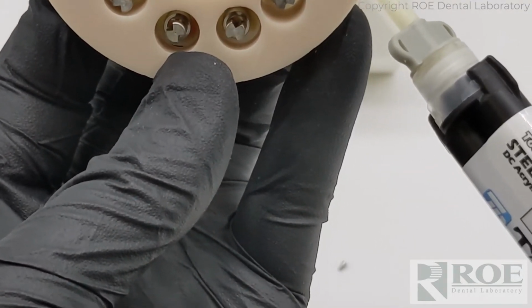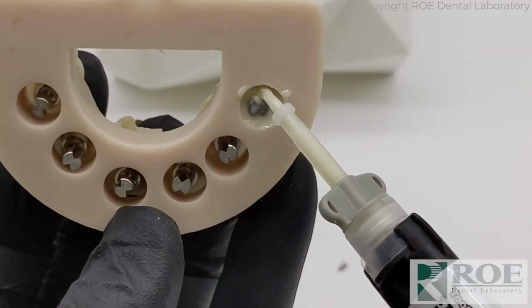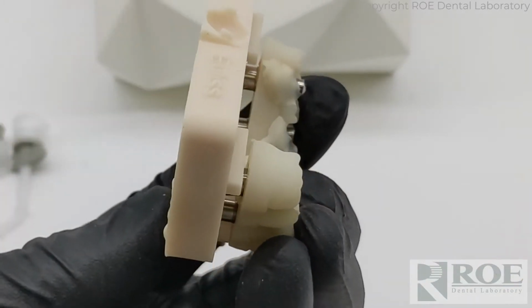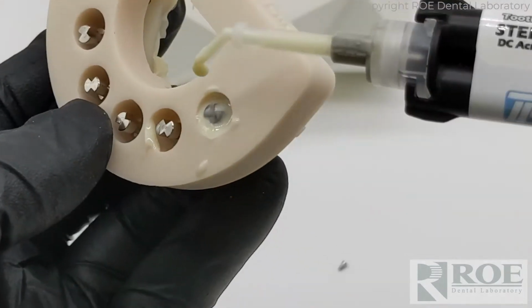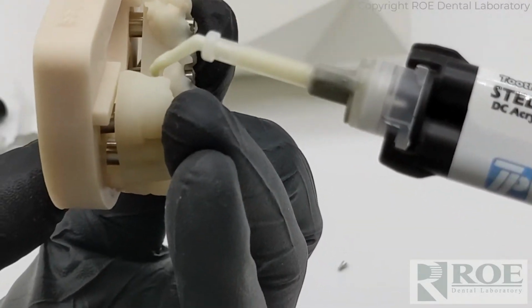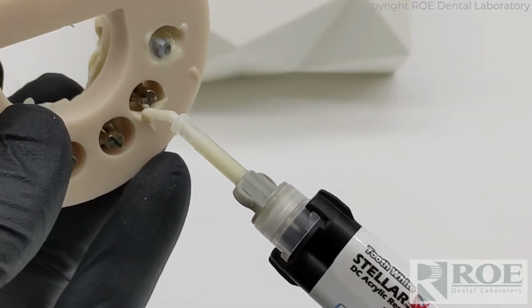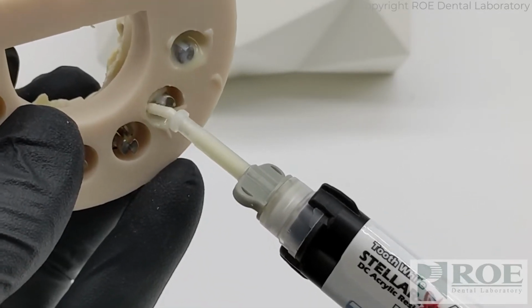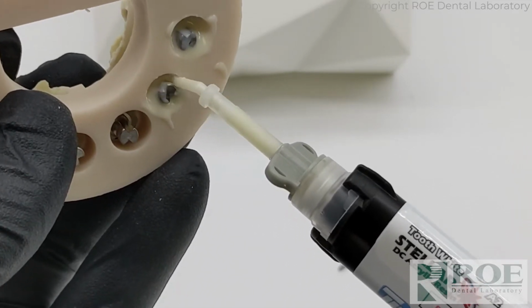But the other very important thing is to not connect the prosthetic to the model. In other words, we are holding this vertically so that you don't have material going all the way through the hole and connecting the prosthetic to the model. That's a problem because then you have to cut the two apart. So to do that, we just don't put the tip in very far, because we can always come back from the occlusal and backfill more of the hole, just to make sure the analogs are secure.